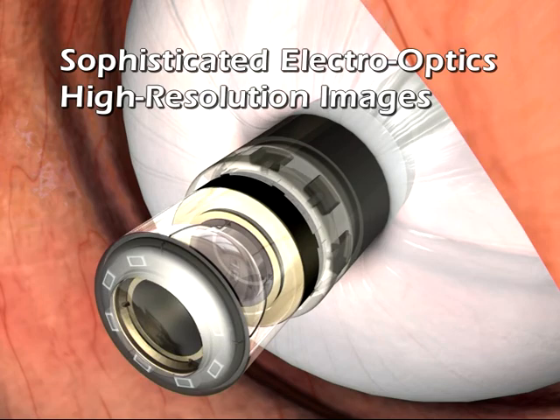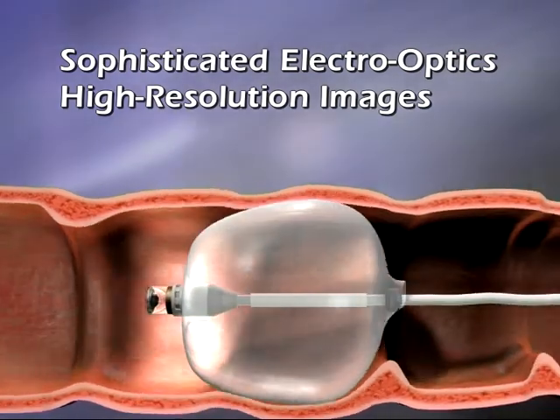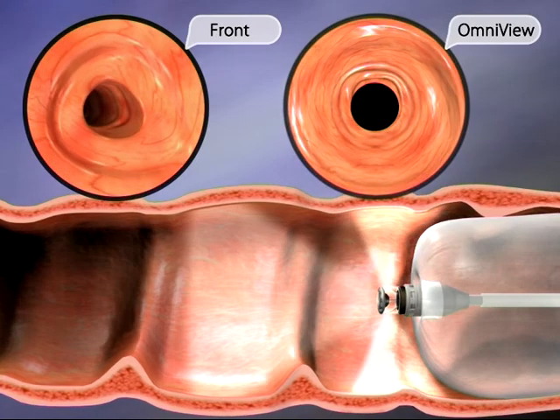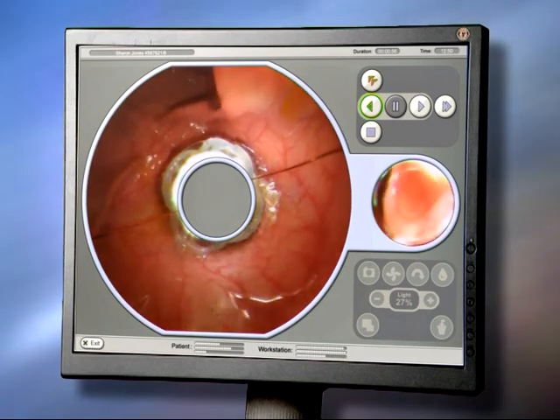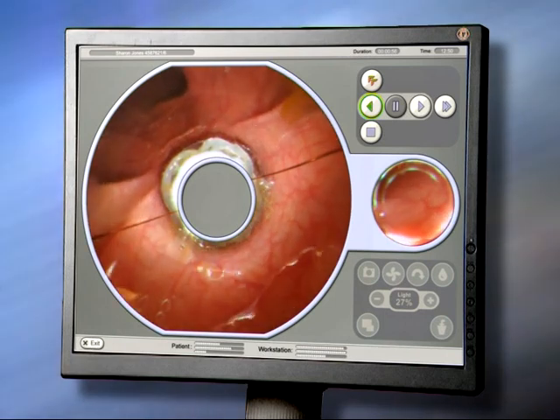Aeroscope's electro-optical capsule features a highly sophisticated digital camera with a protruding optical dome. It acquires high-resolution video images as it travels through the colon. The images are transmitted to the workstation, which displays and records them for real-time visualization and post-procedure review.